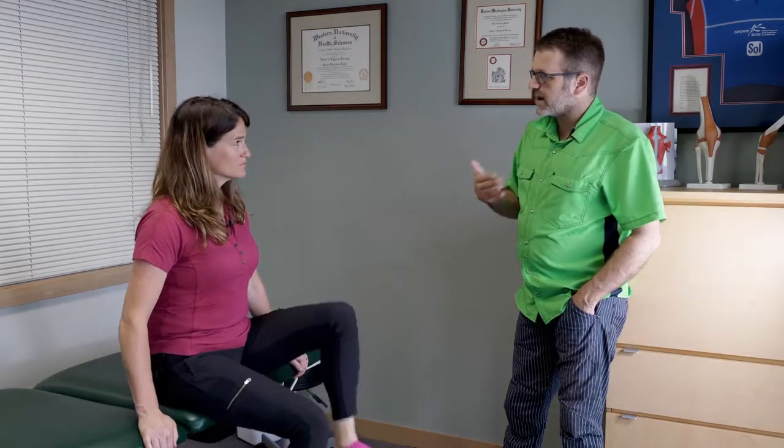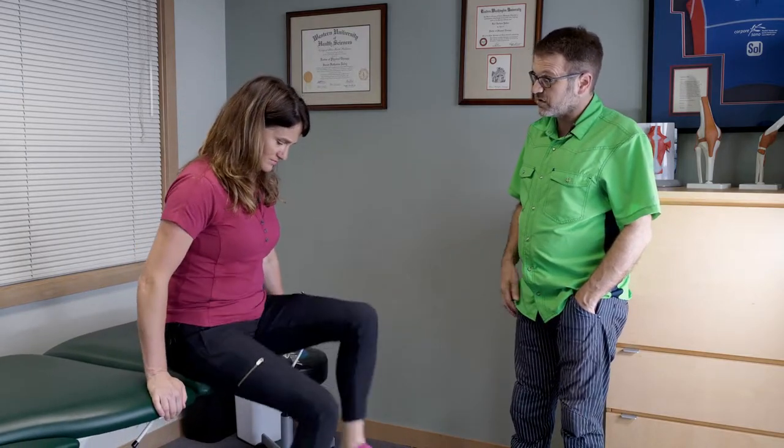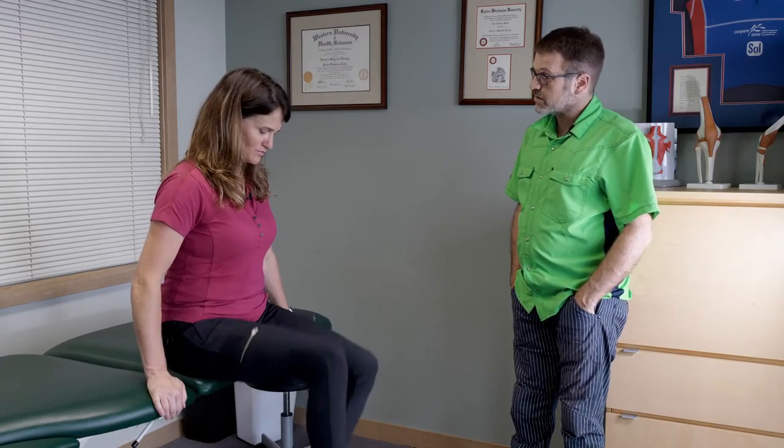We know that with bicycling, a greater degree of knee flexion through the pedal stroke with prolonged exposure puts you at greater risk for knee pain. In a clinical setting, it's not practical to have a person pedal this for an hour. You can expose them to deeper knee angles just for the development of range of motion for a shorter period of time. But for a longer warm-up, say 10 or 15 minutes prior to your session, you'd set them up a little higher for a healthier position for the knee and hip.